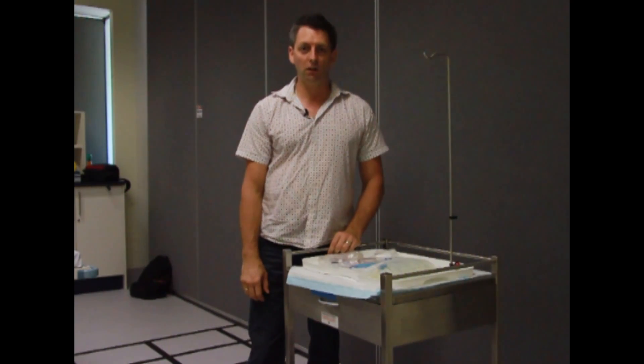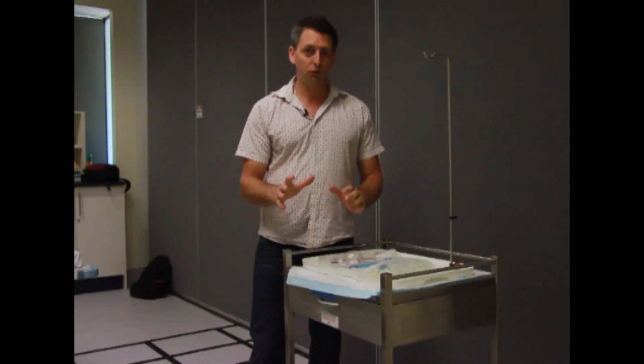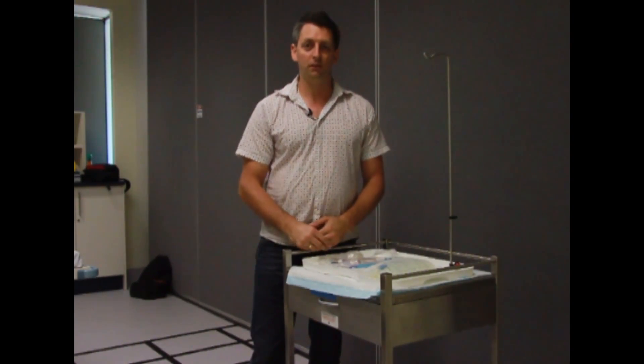This is Nurse on the Go video. Today we're going to look at priming an IV line. It can be a bit of a tricky task at times and there are a few little tricks to help you get through.